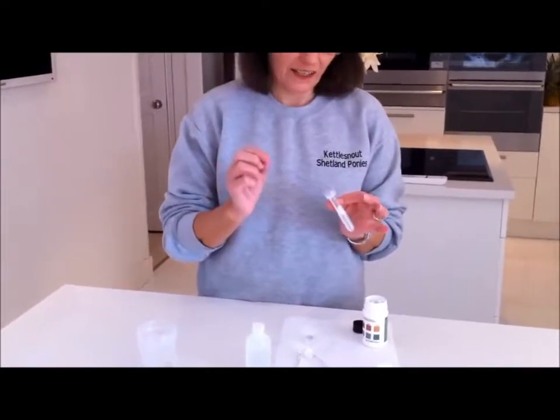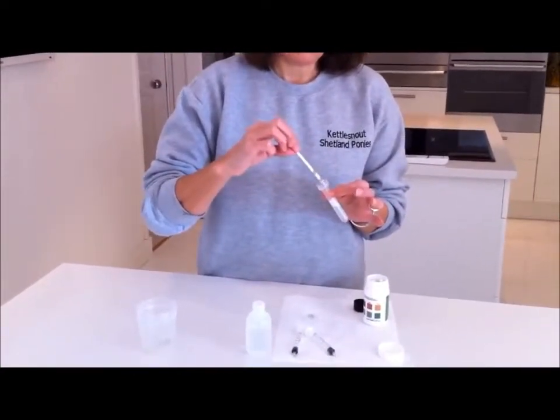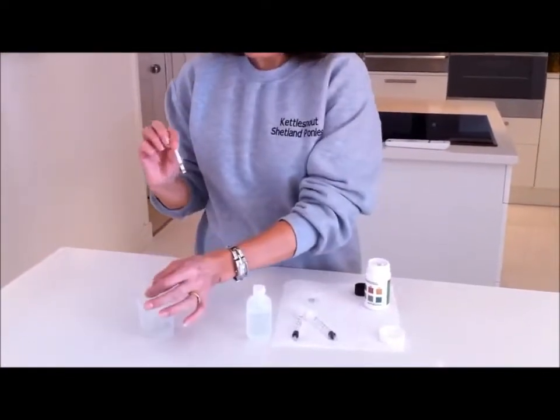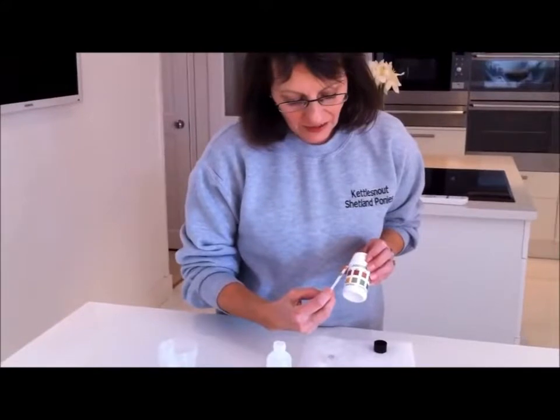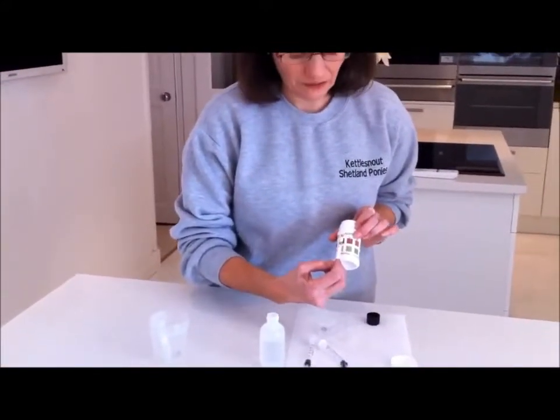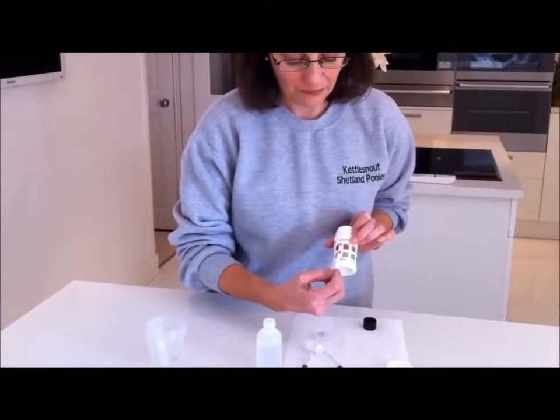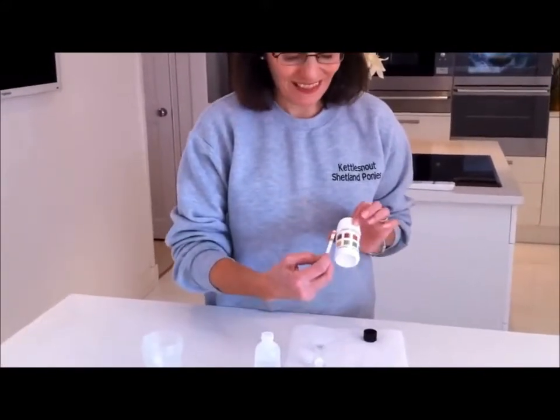Six, seven, eight, nine, ten. Take it out, give it a shake. This has changed from yesterday — she's now in the 85% range of foaling, which could be today or tomorrow now. Exciting!